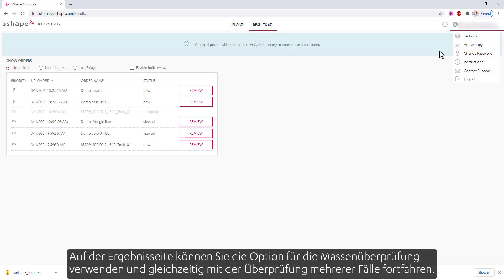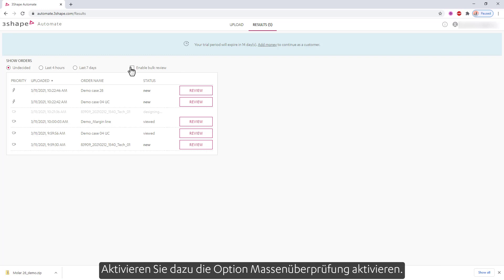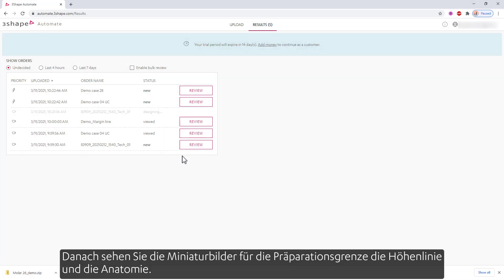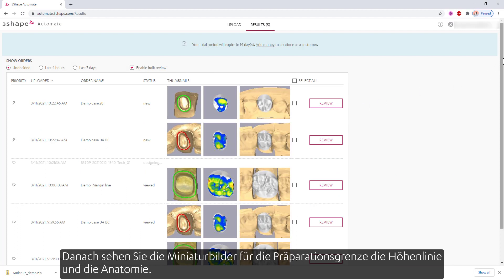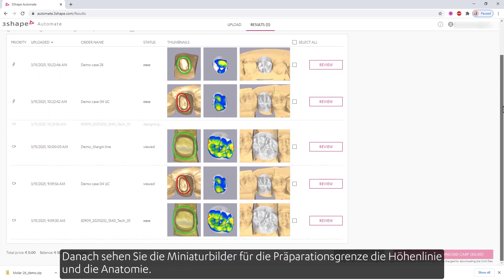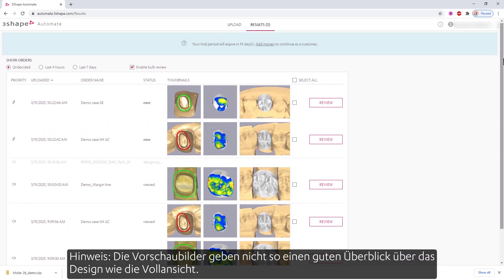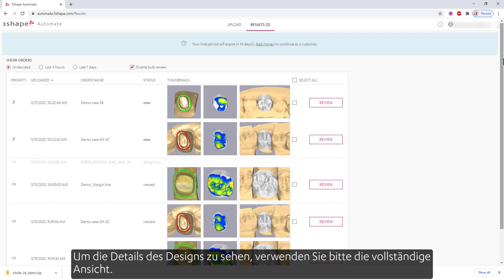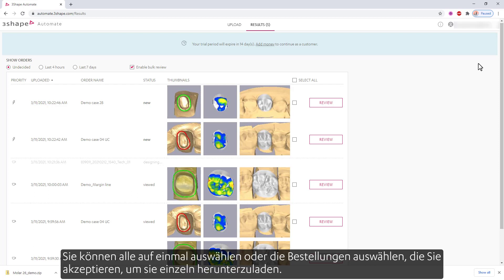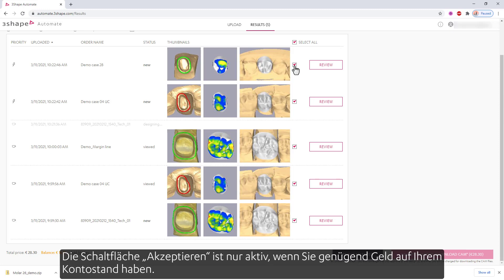While on the results page, you can use the bulk review option and proceed with the review of multiple cases at the same time. To do so, check the Enable Bulk Review option. After doing so, you'll see the thumbnail images for the margin line, heat map, and the anatomy. Note: the thumbnails do not give as good an overview of the design as the full view. To see the details of the design, please use the full review. You can choose to select all at once, or choose the orders that you want to accept to download one by one. The Accept button will only be active if you have enough money in your account balance.